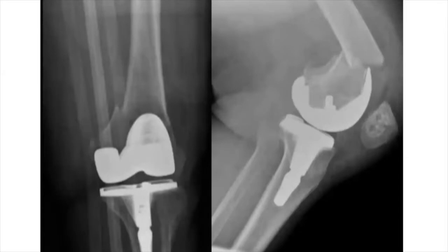So here's one example where I think it's really going to take home the message of where the benefits of carbon fiber can come about. This is a 67-year-old female patient who is a florid diabetic. Okay, she came with a sugar about 230. She's a smoker, and she also has peripheral vascular disease. So you could talk about her having very, very poor protoplasm and poor healing potential, on top of the fact that she's morbidly obese. She has a periprosthetic extra-articular total knee arthroplasty fracture.